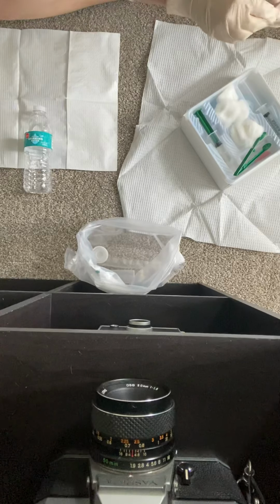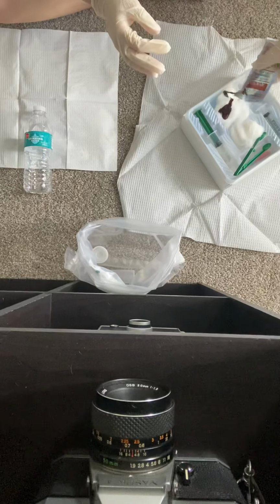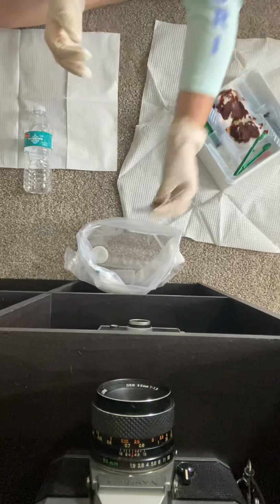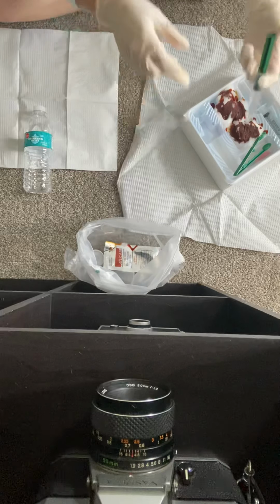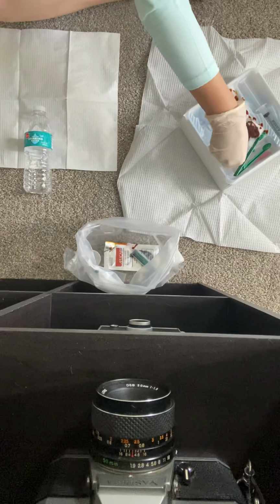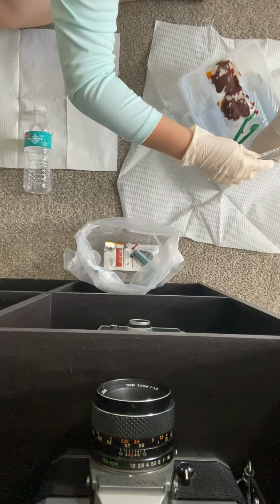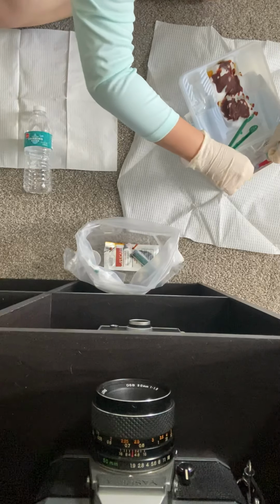Okay. So I'm going to try not to make a mess here since I am at home. Okay, and then I'm going to put that in the trash. And then I'm going to squirt my lube in, and then attach my syringe, because I just want to have that already attached. I'm not going to test my balloon. So I'm just going to have this attached.